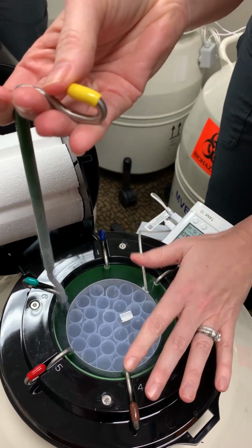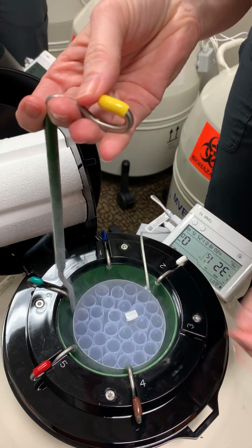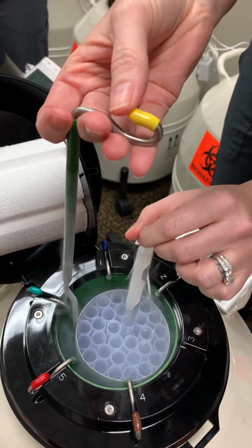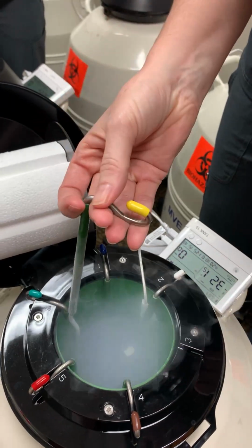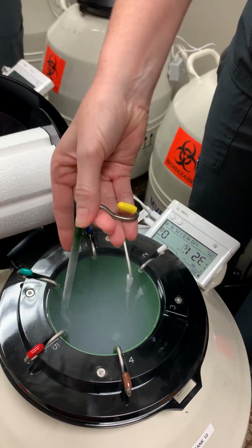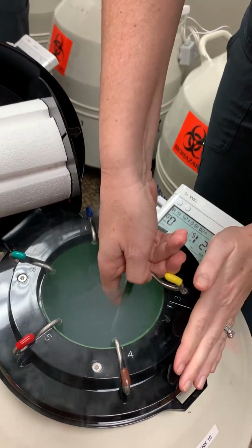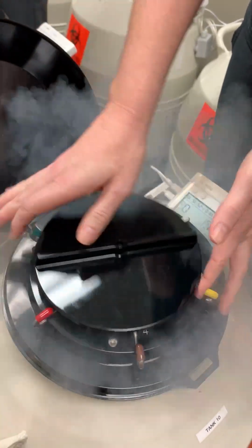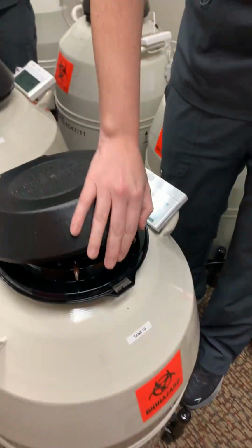So, this is normally what our canes of our specimens would be in. And it would be one of these, which is one I put in here just to show you guys. This is a new tank. So the embryos are on the thing you just pulled out. We'll do a closer up over here. But this is a new tank, which is why it's not full yet. We're growing, and so we needed a couple new tanks to bring in embryos for the NEDC and also for southeastern patients freezing their own.